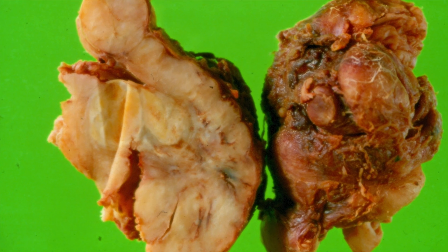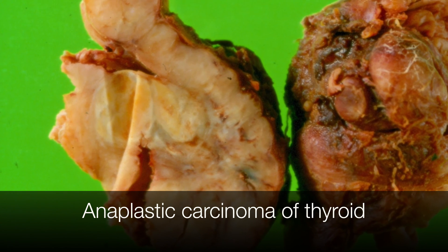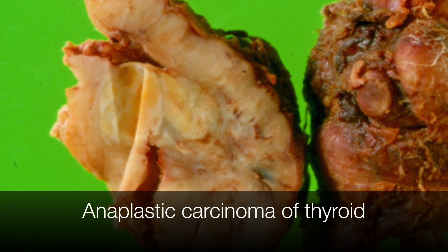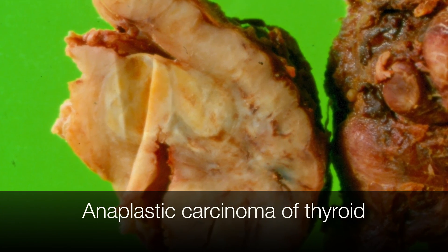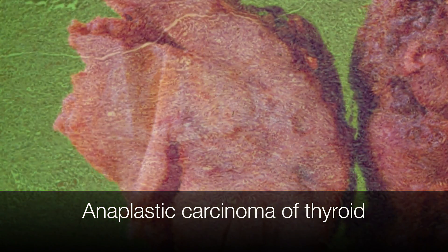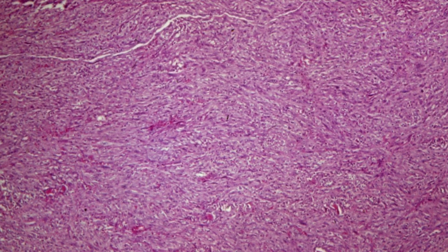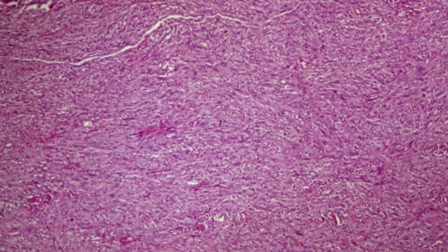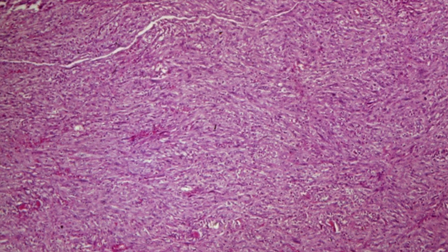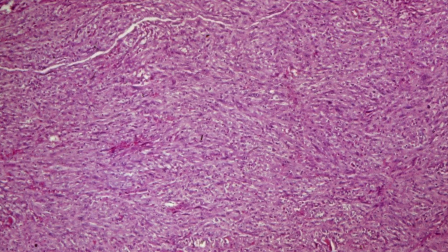This is the gross appearance of an anaplastic carcinoma of the thyroid. The tumour is a solid white area involving the majority of the gland. And this is the accompanying histology showing sheets of anaplastic cells with no evidence of differentiation into thyroid follicles or other recognisable cell types.